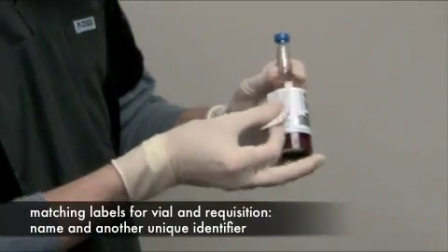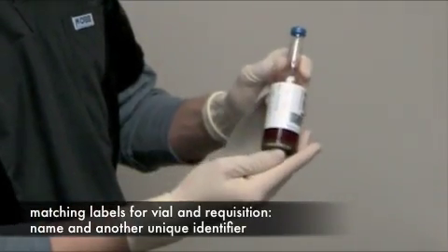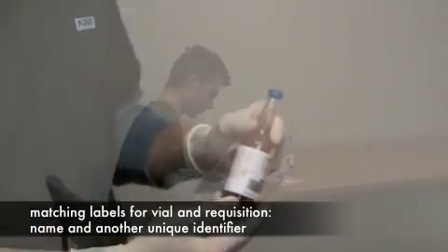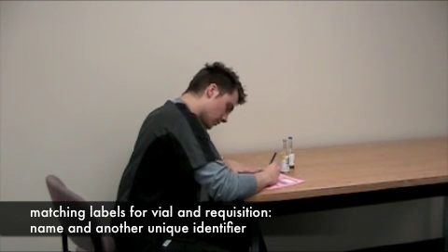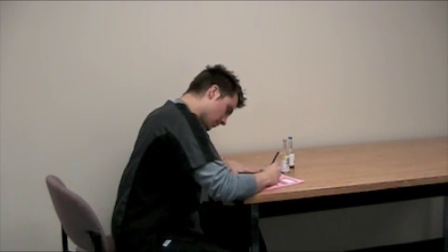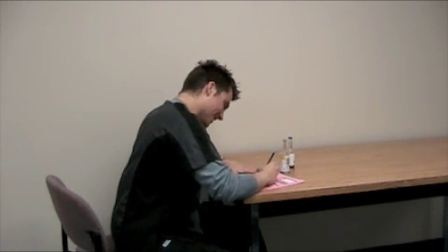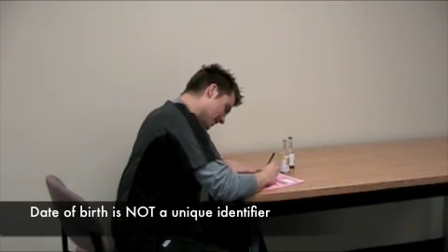Specimen and requisition require matching labelling that includes the patient's name and another unique identifier, such as health card number or hospital unit number. Date of birth is not a unique identifier.